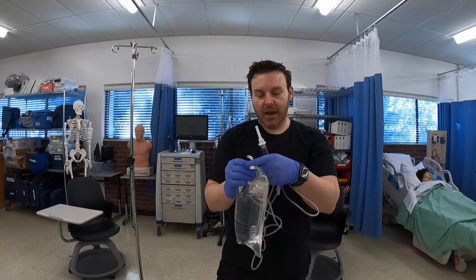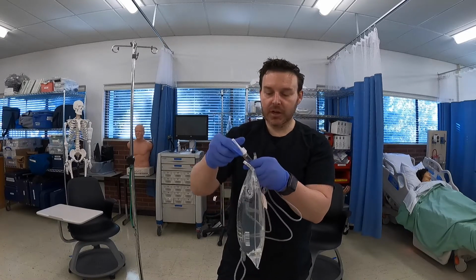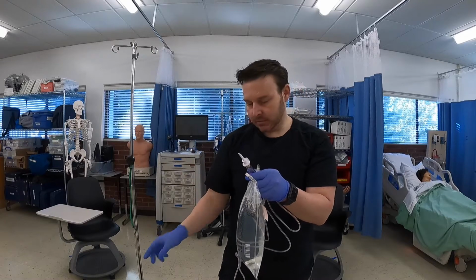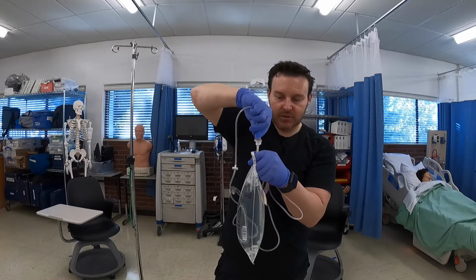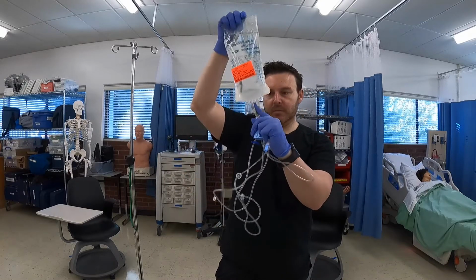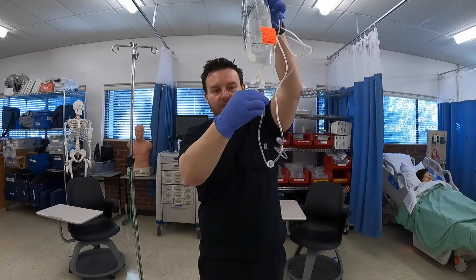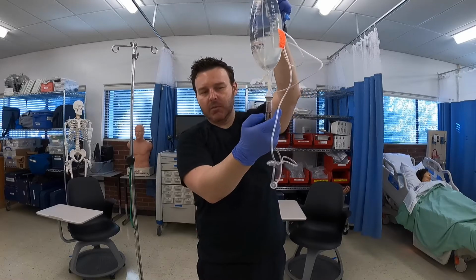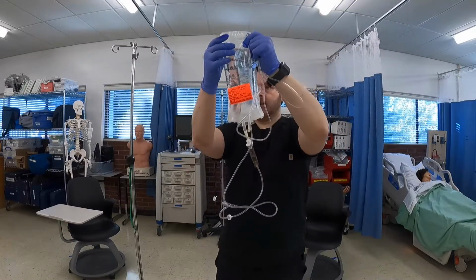And then we will have our drip chamber and spike. So now we can remove your plastic, and then we're just going to go ahead and insert this in here. And sometimes you just got to twist it down. And then we're going to tilt it up like so. And then we're going to give it 2 squeezes. And that way we get it to that line that we wanted to. So it's about quarter filled. And then we're going to continue to prime our tubing.